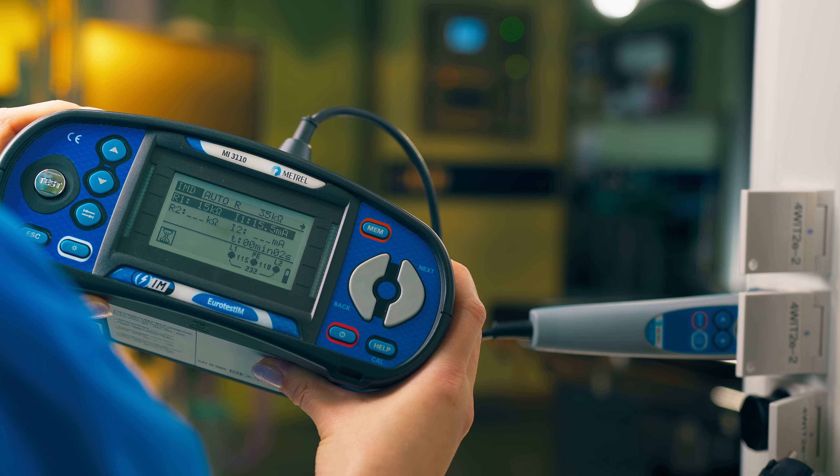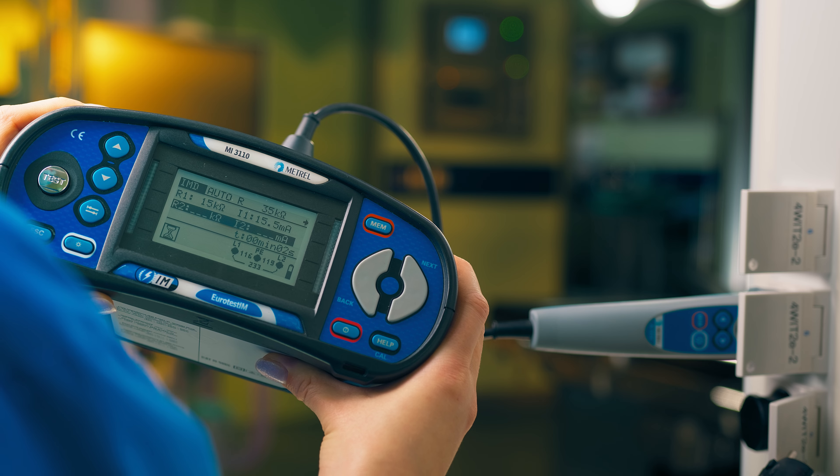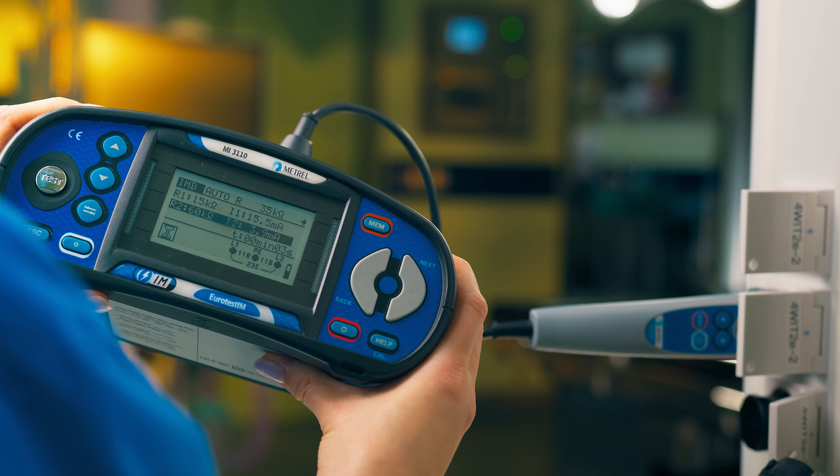This function checks if the alarms get triggered in the event of drops in insulation resistance or when leakage current increases.